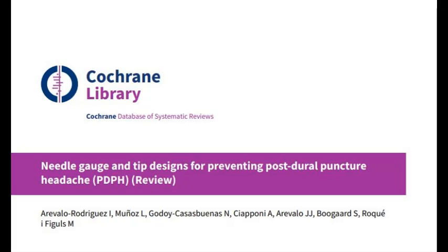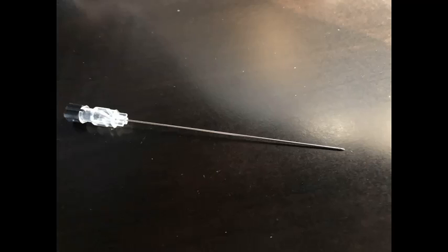Here's a great review paper on this topic. You can access this paper for free, and the article goes into great depth, fleshing out this concept of atraumatic needles and post-dural puncture headaches. After a few spinal headaches, I recently changed my practice to include the pencil tip needles like the one you see here. There are pros and cons.